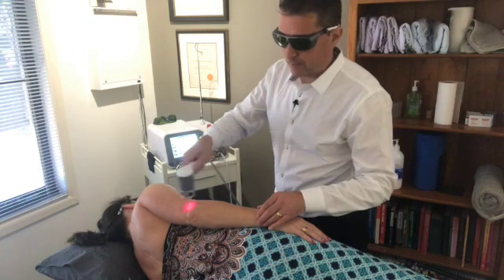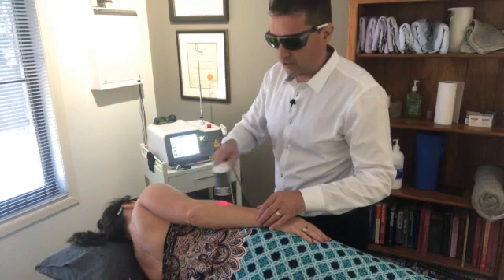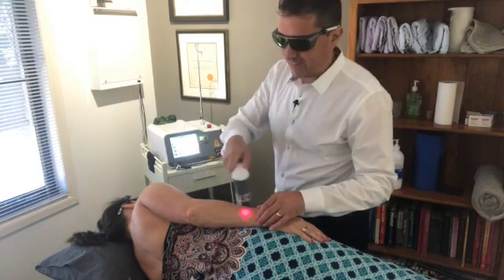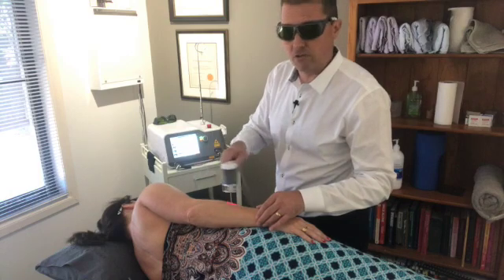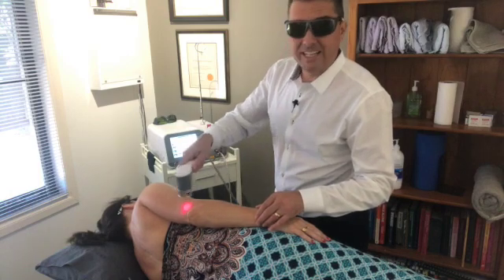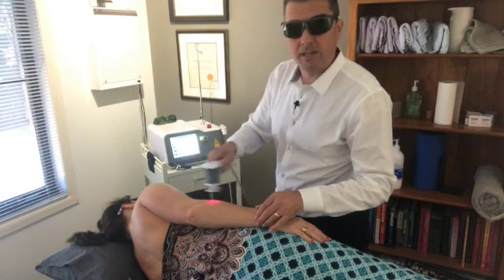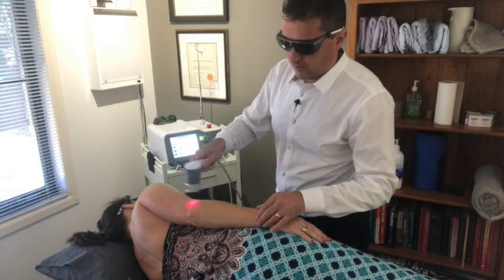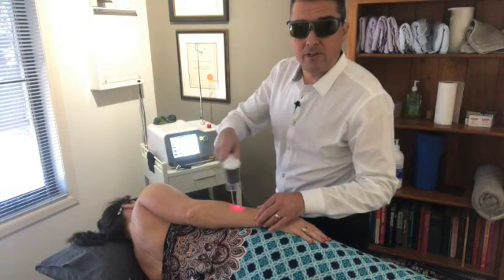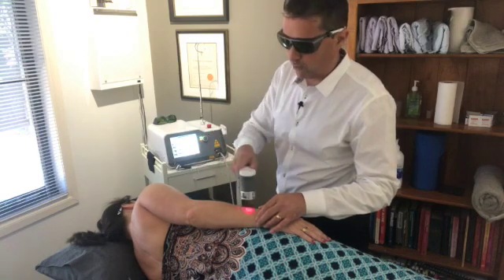With the laser, by speeding up the rate of healing and triggering tissue regeneration, we have had cases where people with tennis elbow have had long-term relief after just one treatment. More likely it's in the four to eight range, with six probably being the average. The other benefit is the treatment feels really comfortable — just a lovely warming feeling all the way along the arm.